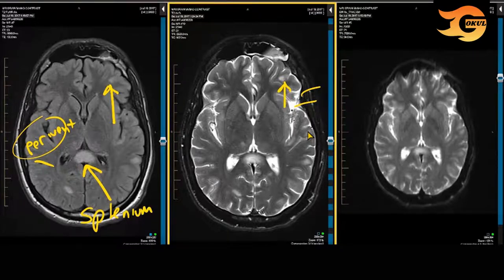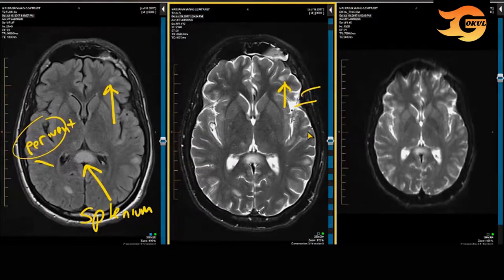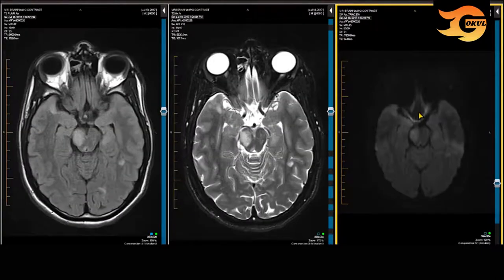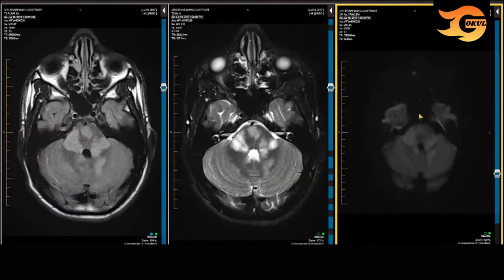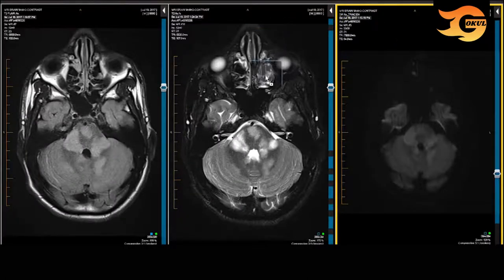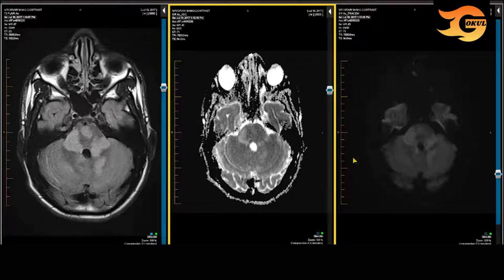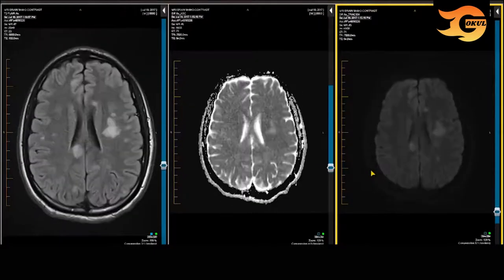Currently we're on the B0 map on the diffusion-weighted imaging. I will scroll until we get to the B1000 images to look for areas that are bright in signal intensity. We would have to correlate that with the ADC map to determine whether or not there actually is restricted diffusion or whether this is merely T2 shine-through. On the ADC map, T2 shine-through is bright in signal intensity, whereas active cytotoxic edema is going to be dark in signal intensity.